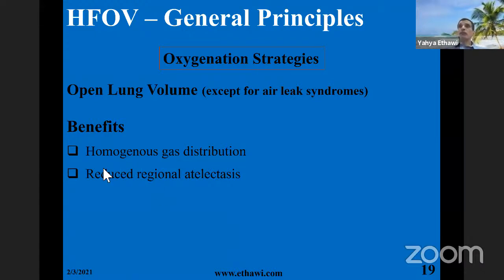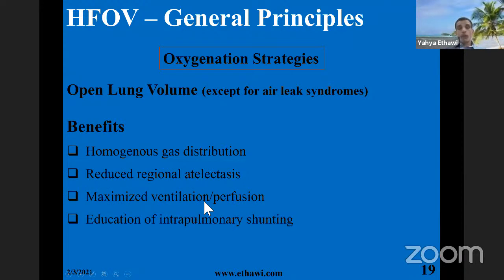We achieve maximum ventilation perfusion match, causing reduction of intrapulmonary shunting. And in high frequency, we are able to use a lower FiO2.